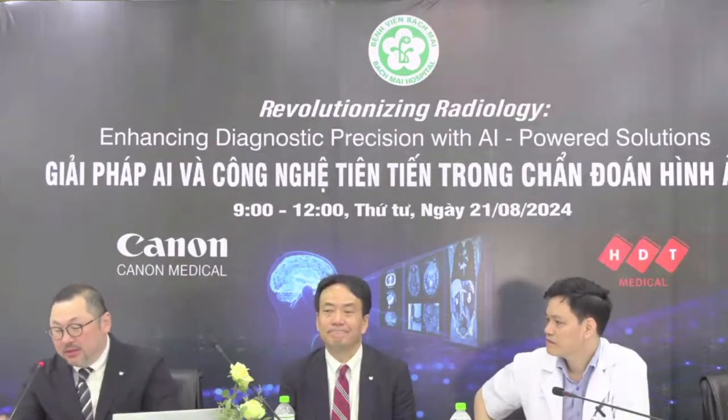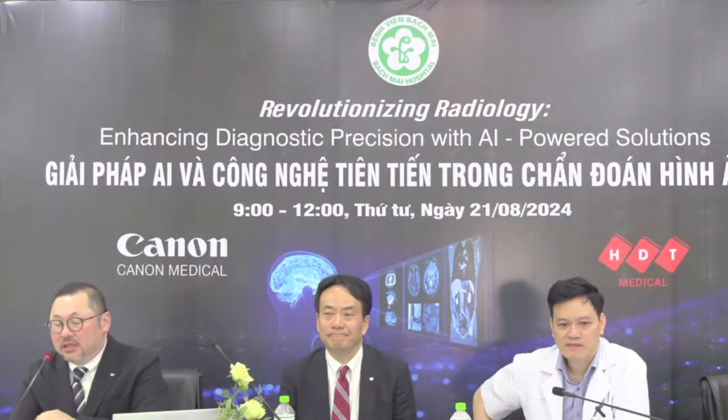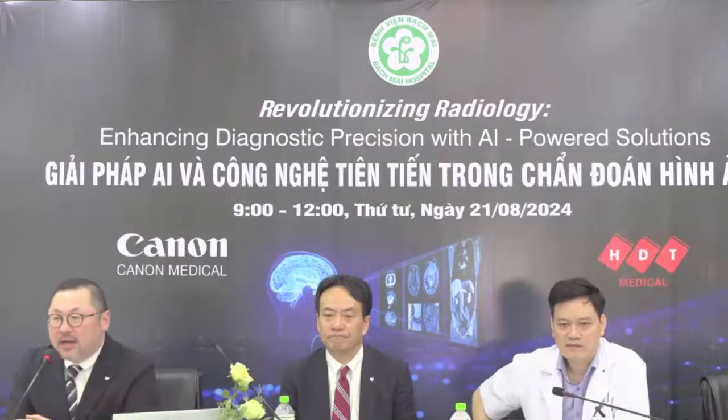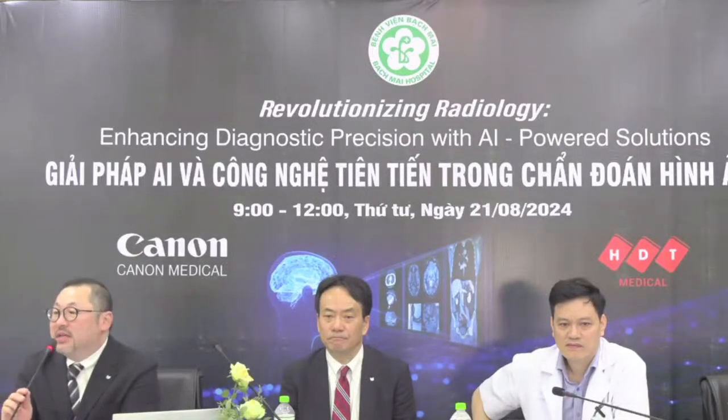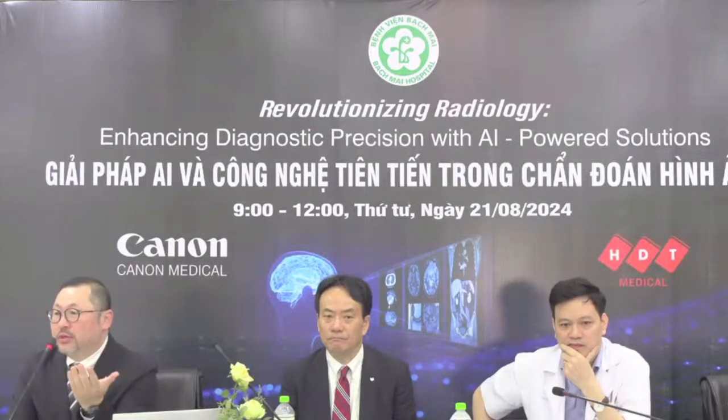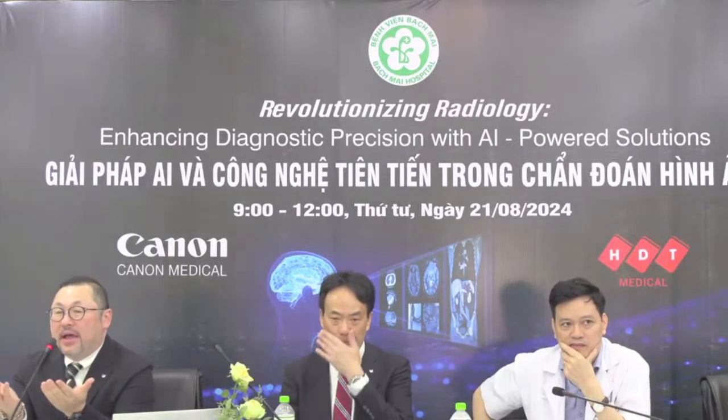Okay, thank you, Dr. Chang, for the questions. I think this is a question that has been asked many times, whether our AI is able to accept images or data from other scanners. As we know, the principle of deep learning is training pairs. Training pairs means we use input and output to compare, and then this AI algorithm picks up the difference and trains.